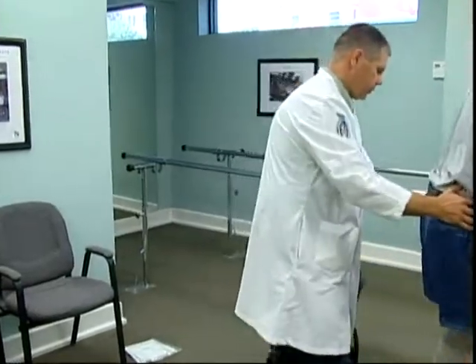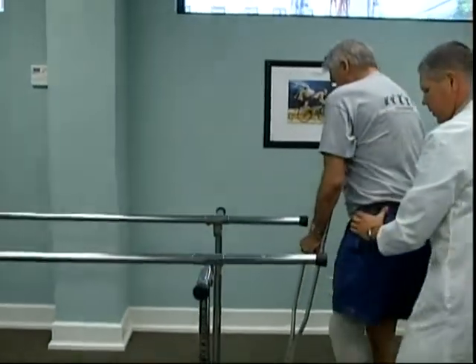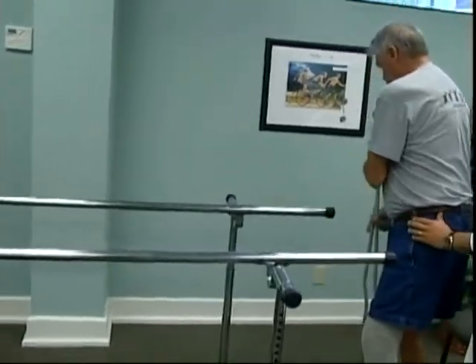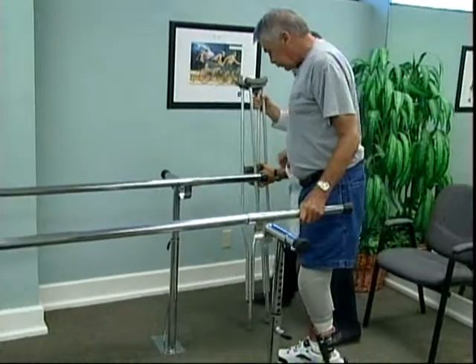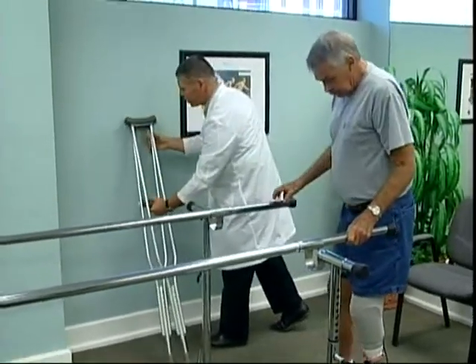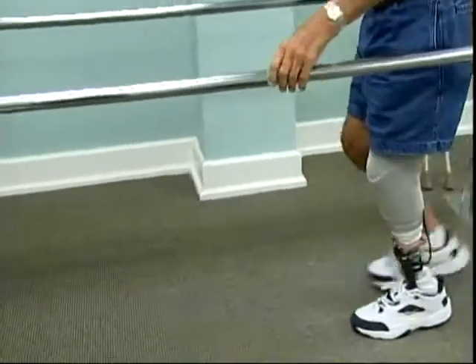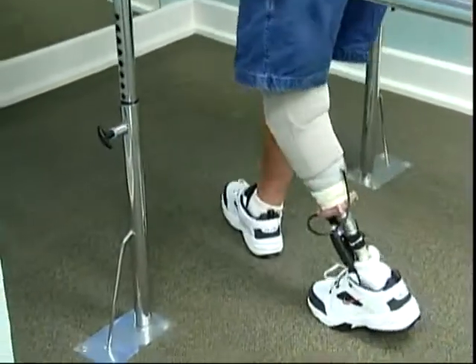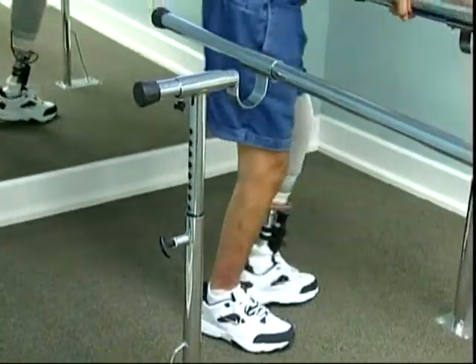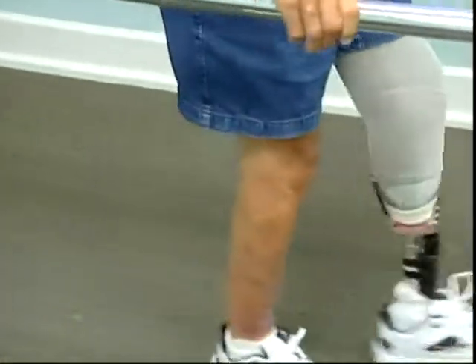I notice he has movement both side to side and front to back, which is just like a regular ankle. That's exactly right. The foot component we chose for Mr. Sykes is one which has dynamic response as well as multi-axial ankle function. He lives out near the lake in Louisville, lives on a farm, and needed a foot that would be very ground compliant. So that'll help with uneven terrain.